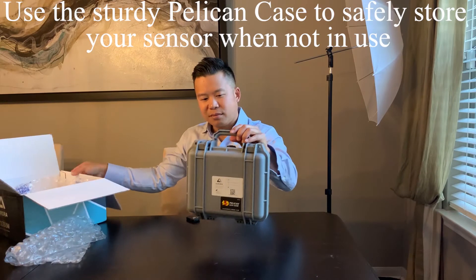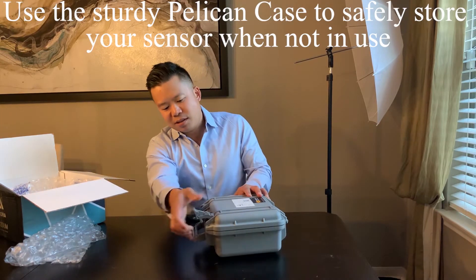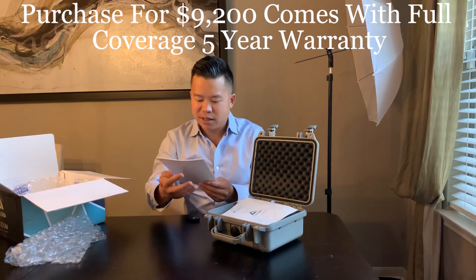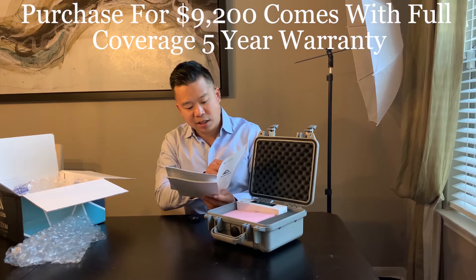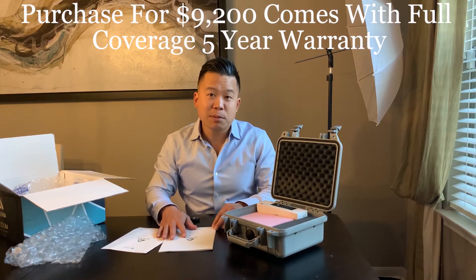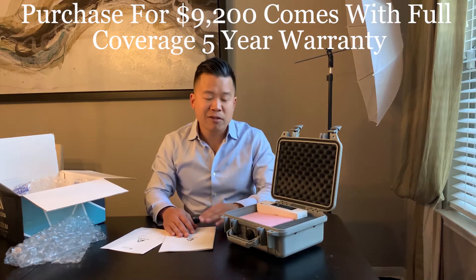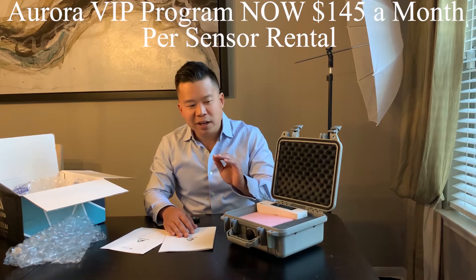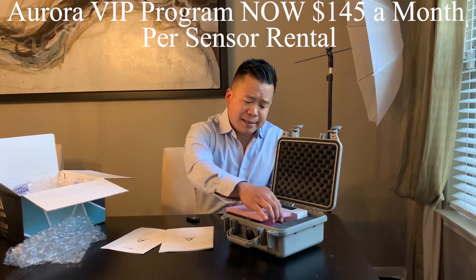There's plenty of bubble wrapping inside. This is my first time opening it. Two nice snaps to open — it sounds very durable. We can see inside there's a padded case, a manual, and warranty information. One of the highlights of this system is you have two options if you decide to use the sensor: you can purchase it outright, or pay a monthly fee — I believe it's $175 a month — which gives you the sensor to use with a very comprehensive warranty that will replace or repair it for any damages done.